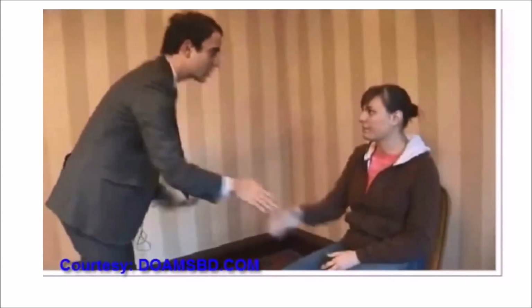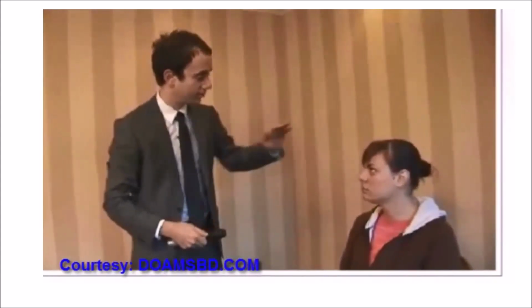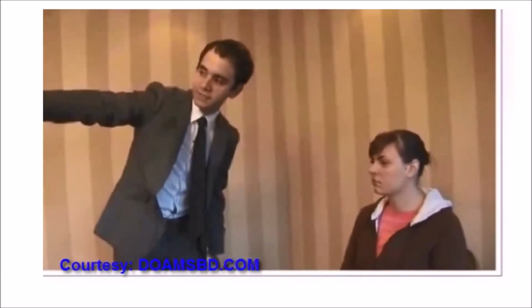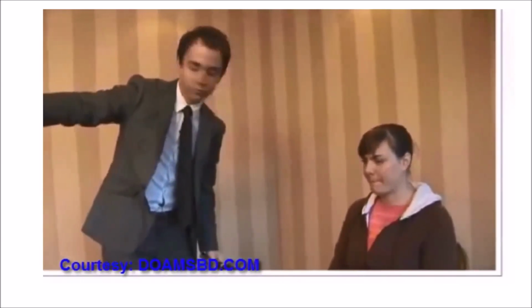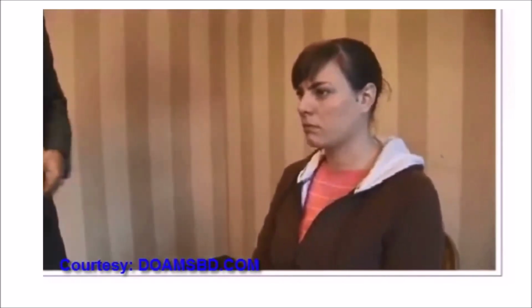How to do it? Hello there, Sarah. My name's Anthony Kawadra. I'm one of the doctors. Is it okay if I examine your eyes? Of course. Okay, thank you very much. I'm going to be using a bright light. Don't worry, it won't do you any harm, and I'll be coming in quite close. I just want you to look at the distance target there. And if you could just stay looking at that, even if I get in the way, just imagine you can see through me. Can we please have the lights dimmed?